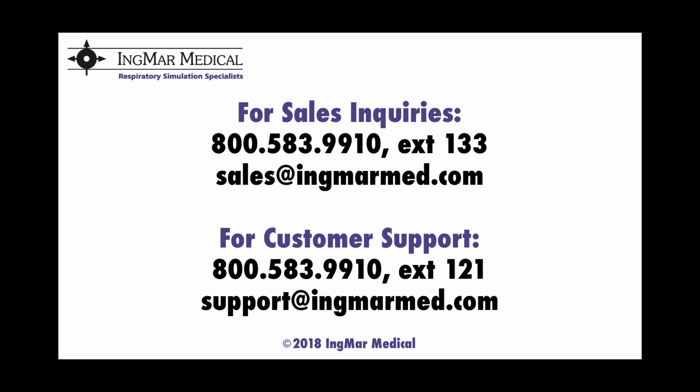It's usually Ingmar Wi-Fi. And then you would choose your connection type as Ethernet, because even though you're wireless, it is still an Ethernet connection from the router to the ASL 5000. And you could simply use your laptop anywhere you would like and have the ASL with the router sitting on top of it. That would be the best way to run the ASL 5000 wirelessly.